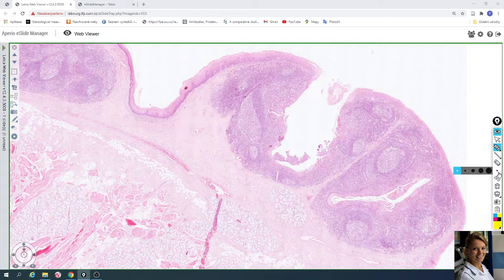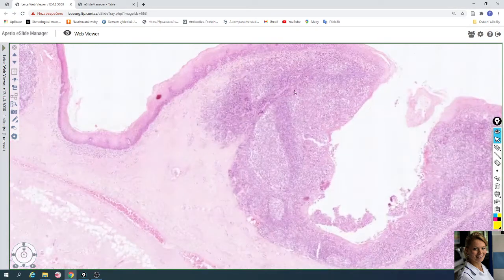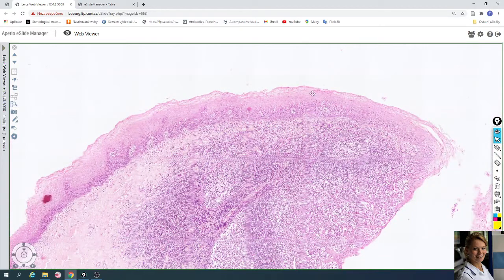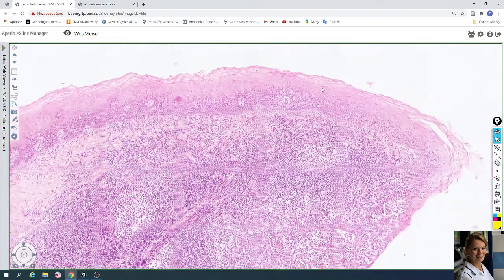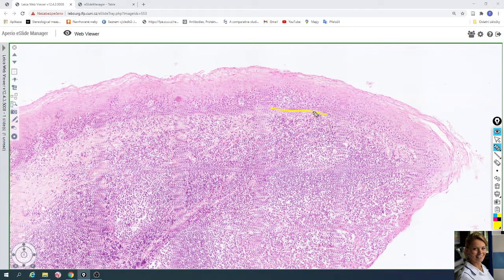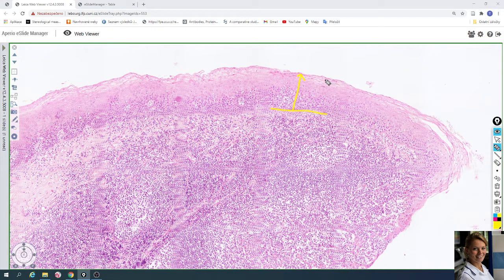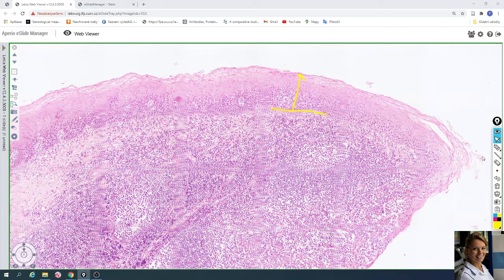The surface of the lingual tonsil is covered by stratified squamous non-keratinized epithelium. Here you can see the structure of this epithelium — the basal membrane and multiple layers of cells. The apical layer of cells contains squamous nuclei, which is why the epithelium is called non-keratinized.